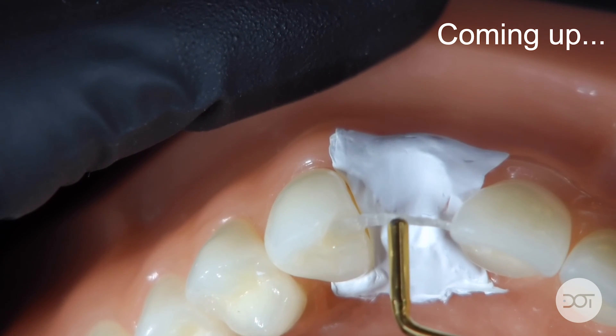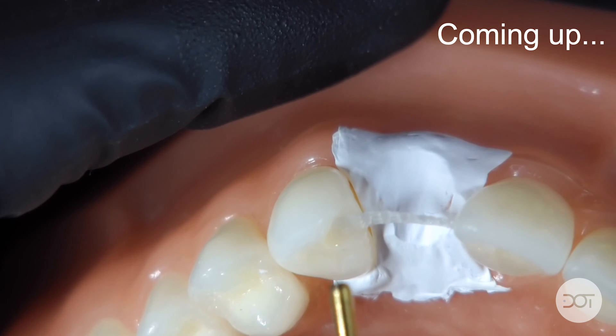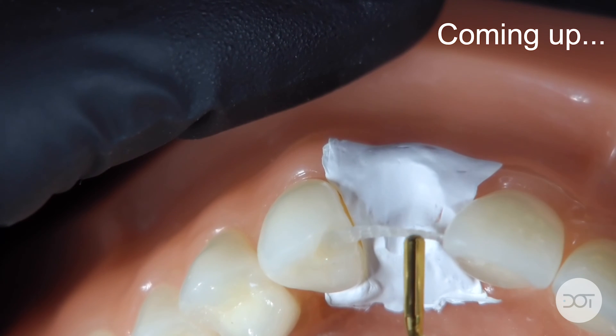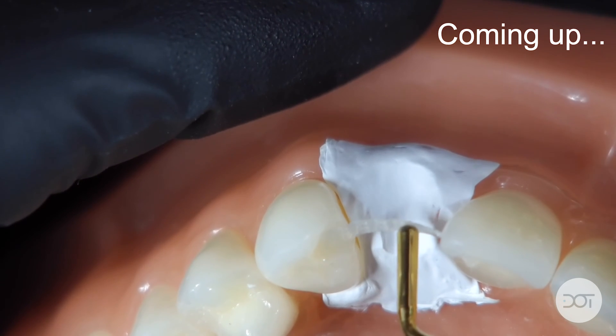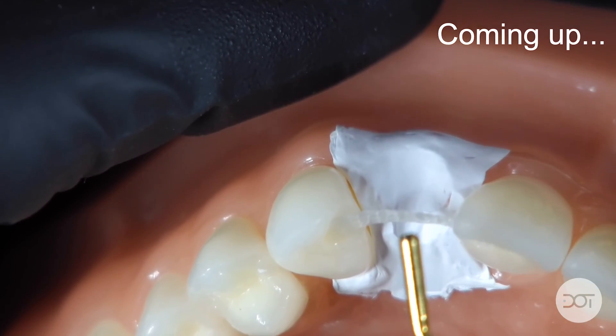The key when doing rib bond bridges is to adapt and bond the first contact that will hold it in place. Then you can contour the band or the rib bond and bond the second contact.